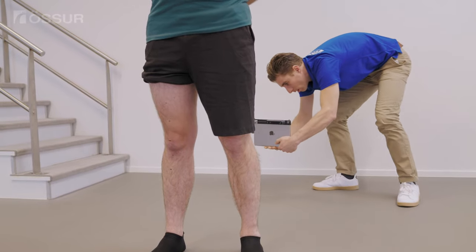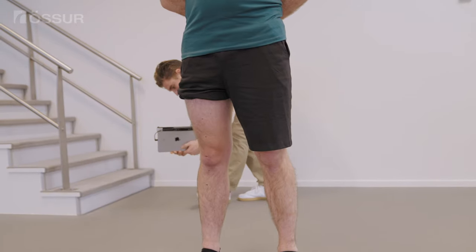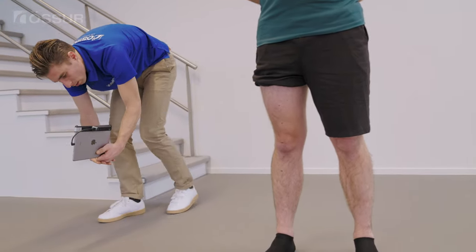When 3D scanning, position the knee straight and the foot 90 degrees to the lower leg, in a standing, weight-bearing position if possible. Ensure you have enough space to move around the whole leg.